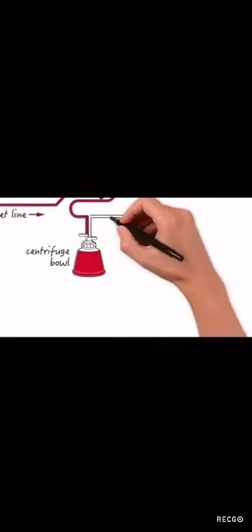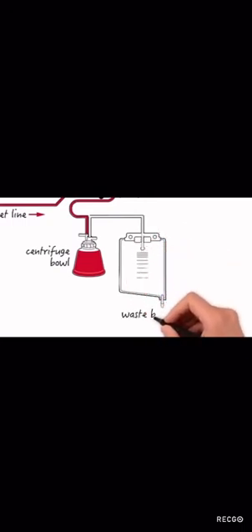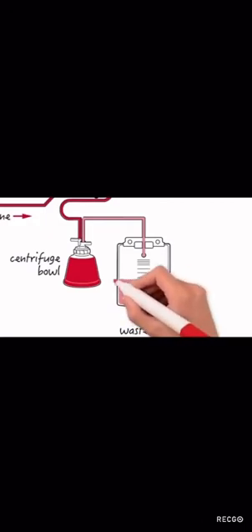As the cylinder spins, most of the dense substance moves to the outer wall. Maximum packing of the bowl with red blood cells is responsible for the majority of the removal of contaminants: debris from the operating field, plasma and plasma-free hemoglobin, platelets, and white cells. These are collected in a waste bag and discarded.